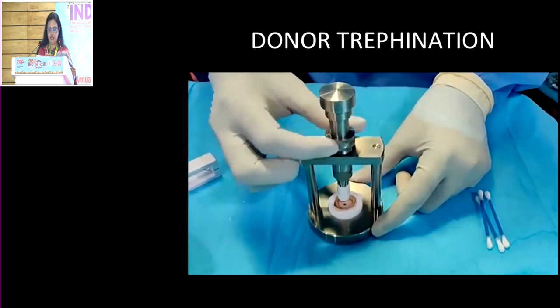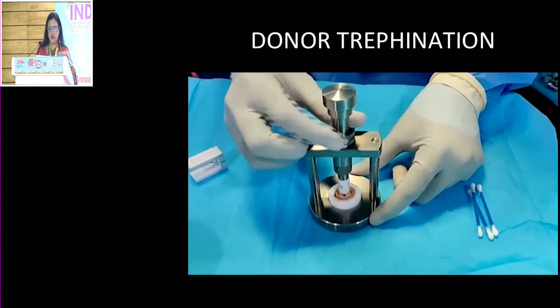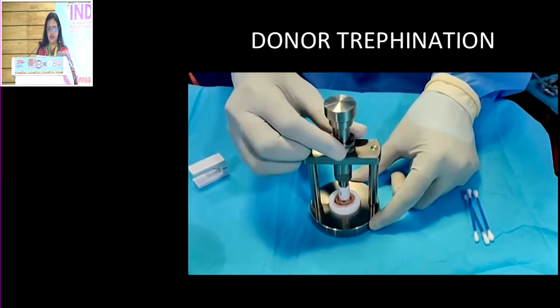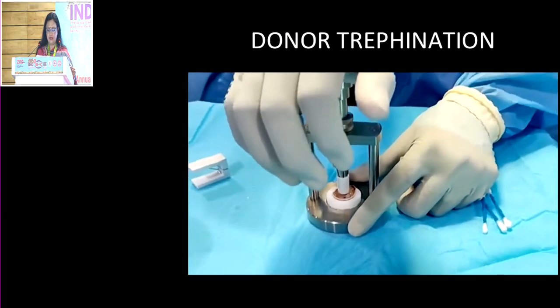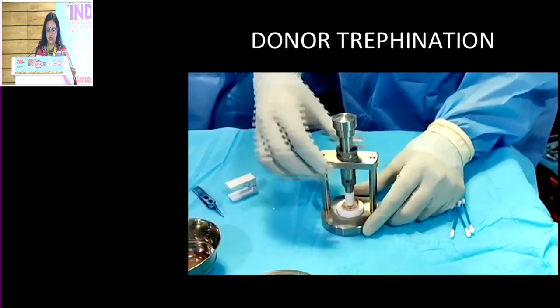The Teflon block is centered, and you place a mark to make sure it is well centered. This centration is very important because when you punch and get a graft that is not well centered, suturing is going to be difficult and that can actually induce more astigmatism. So once you've done that, you just give a nice punch and get the size of graft that you desire.